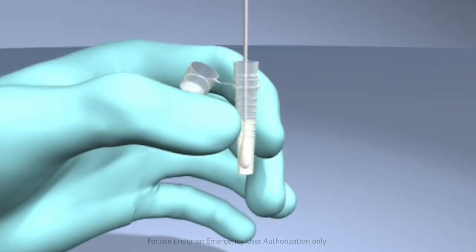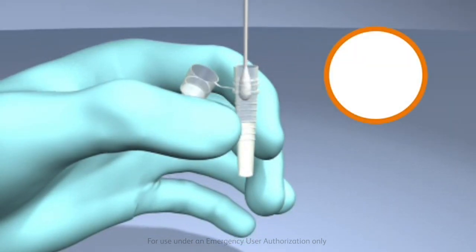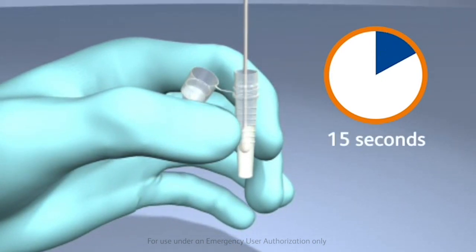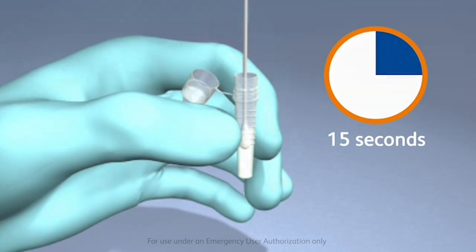Fully insert the swab into the unitized tube, ensuring that it is immersed in the liquid processing reagent, and plunge the swab up and down in the fluid for a minimum of 15 seconds, taking care not to splash contents out of the tube.